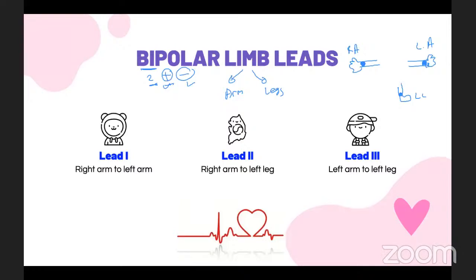This is the mnemonic, guys, or the trick to memorize. It's on the left. Yes, everyone's saying on the left side. Good job, guys. So it's on the left side. The heart is usually located on the left side. So if it's present on the left side, add a positive sign on the left arm, positive sign on the left leg. We'll add 2 positive signs on the left legs, okay?